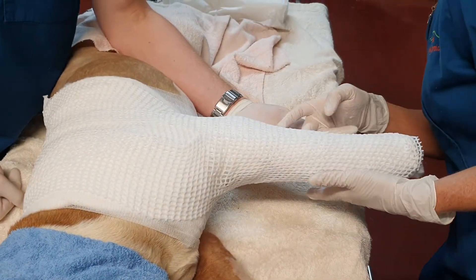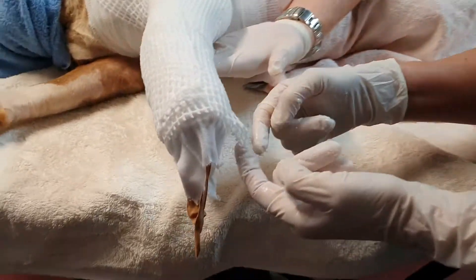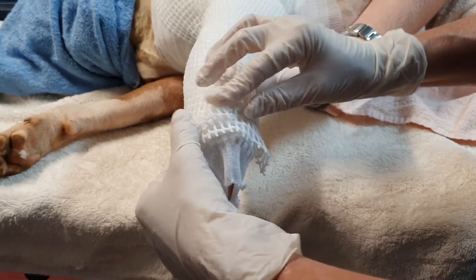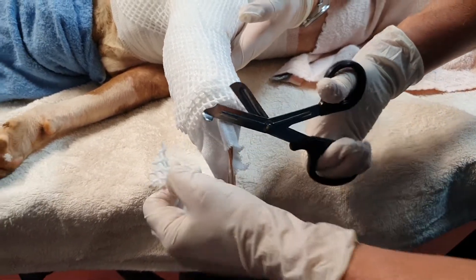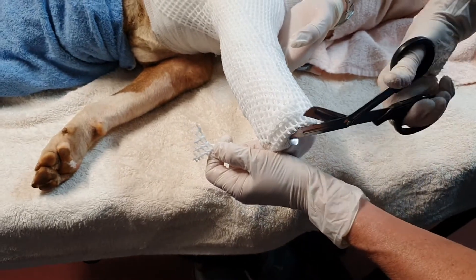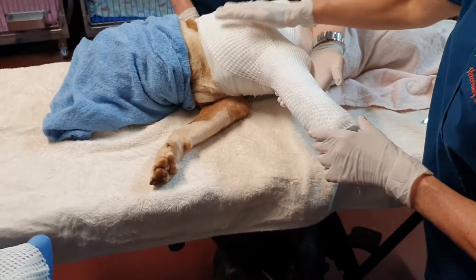My trusty assistant has held the dog's leg in a good position. With this material, if you end up with an ugly point that could cause problems, just get your scissors and cut it off rather than removing the whole thing. I'm just going to round that off and take all these little points off — they might cause grief or rubbing. We'll pause there while that sets.